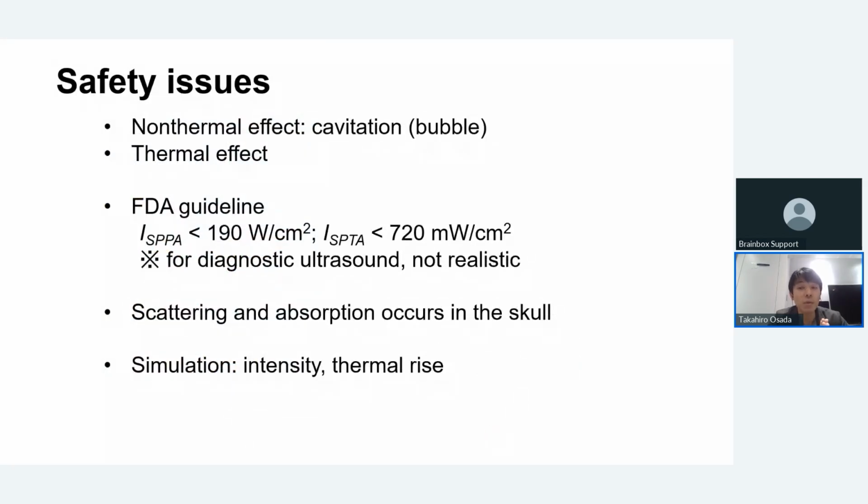Basically, TUS with low-intensity focused ultrasound is safe. But two safety concerns must be addressed. One is cavitation, or bubbles formed by positive and negative pressure. These are termed non-thermal effects. The other is thermal effect. The FDA has established a guideline for ultrasound safety, but this was designed for diagnostic ultrasound rather than TUS. The values are not directly applicable to TUS.